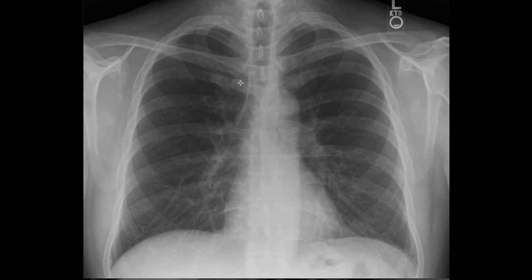Another thing in the evaluation criteria is the patient position. So how do you know when your patient is positioned properly? By looking at a group of aspects within the chest. So number one, we have rotation and tilt. Tilt is when the body moves from side to side, or from left to right. When the chest radiograph is tilted, you will realize that the spine has gone towards the left or towards the right. This is how you indicate tilt.